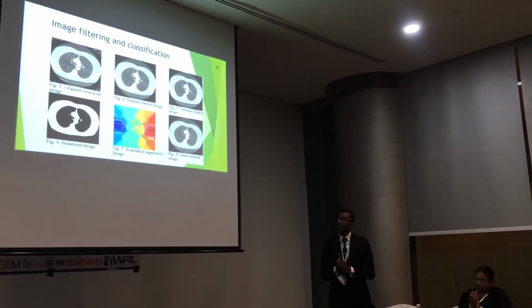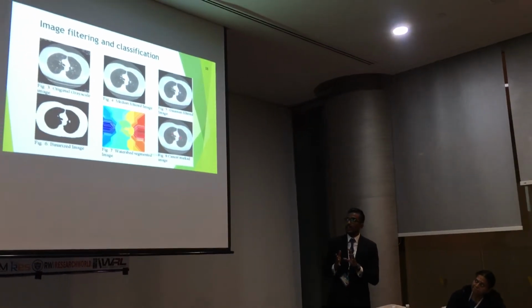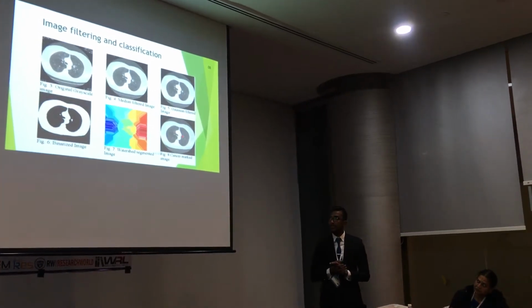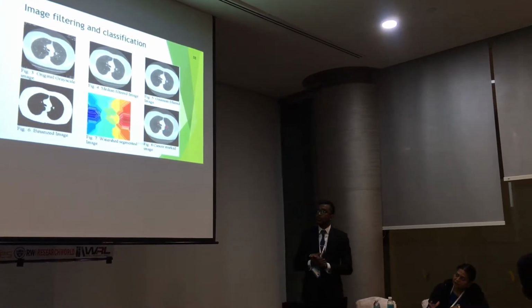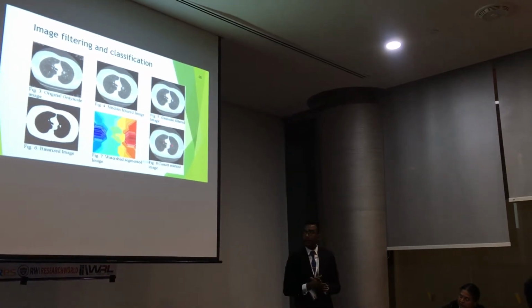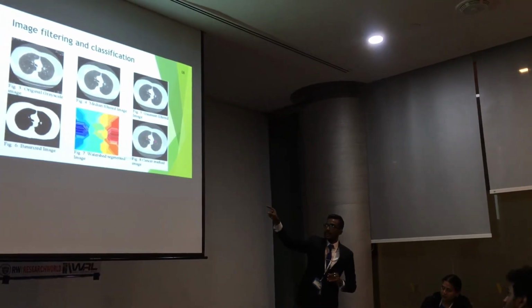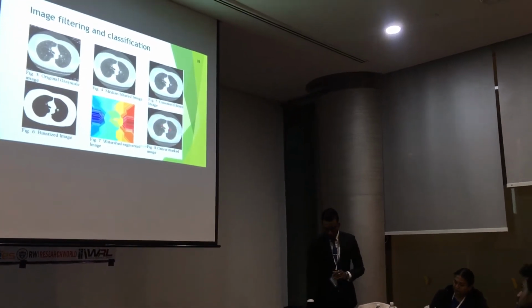In this figure, here you can see figures 3, 4, 5, 6, 7 and 8: original grayscale image, median filtered image, Gaussian filtered image, binarized image, watershed segmented image and cancer marked image respectively. So in figure 6, there are two white dots on a black background. It was marked as a cancer image through the CT scanner. So, nodules. You can see this.